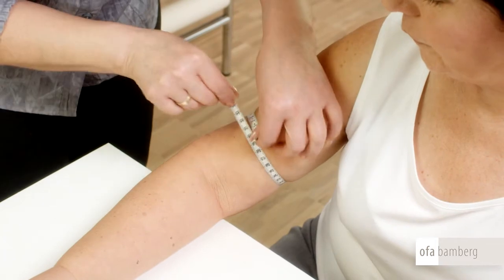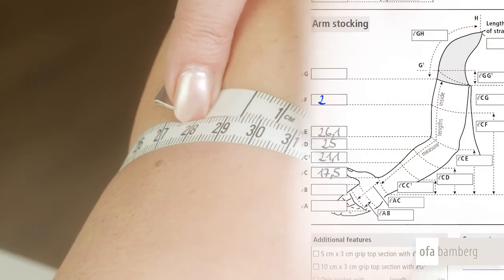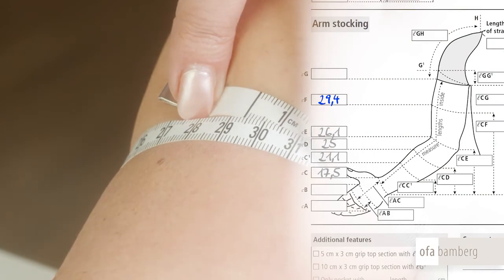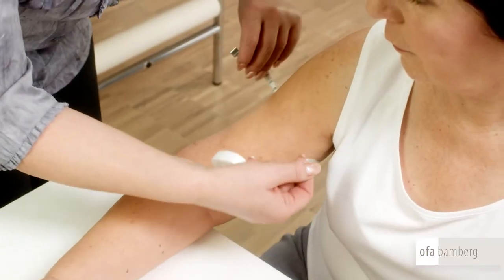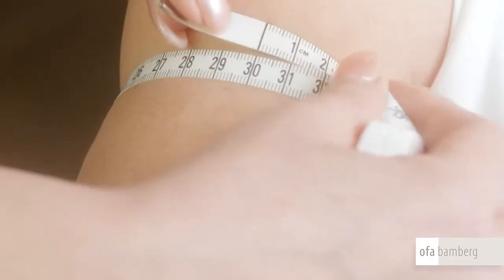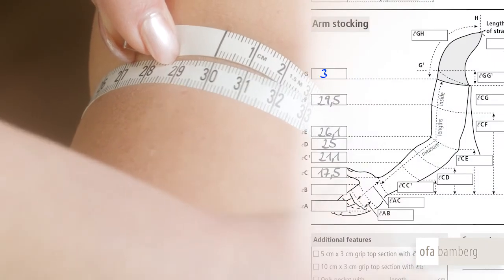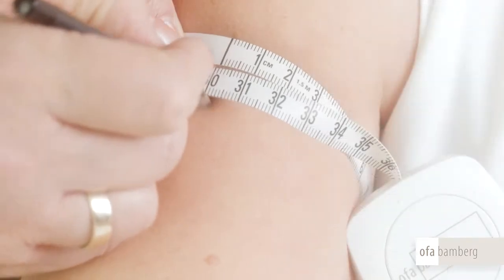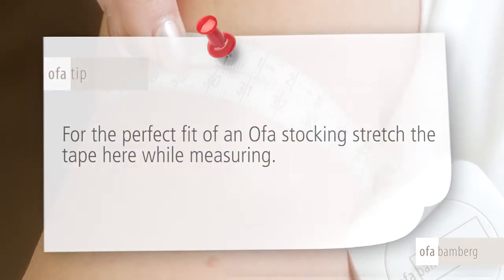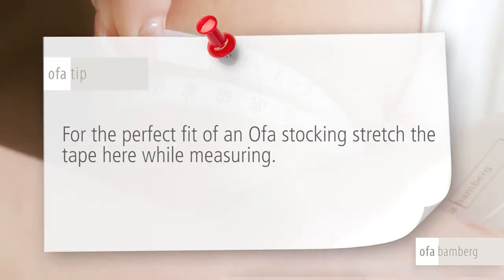The next measuring point F is located in the middle of the upper arm. Stretch the tape while measuring its circumference. Measuring point G is located at the armpit and its circumference should be measured without stretching the tape, at a perpendicular angle to the arm axis. OFA tip: for the perfect fit of an OFA stocking, stretch the tape here while measuring.